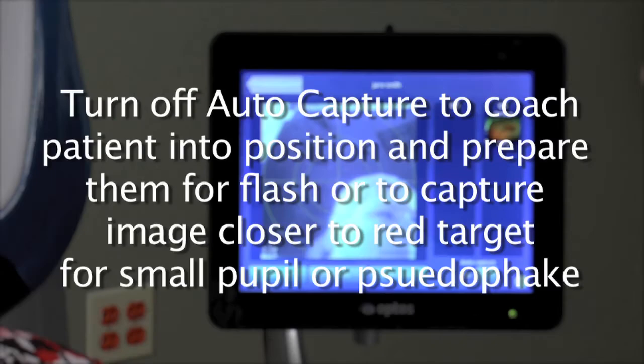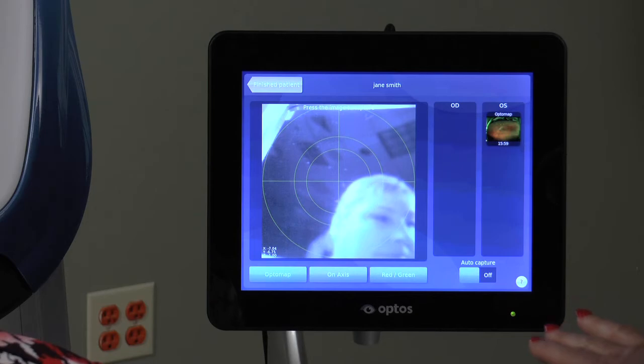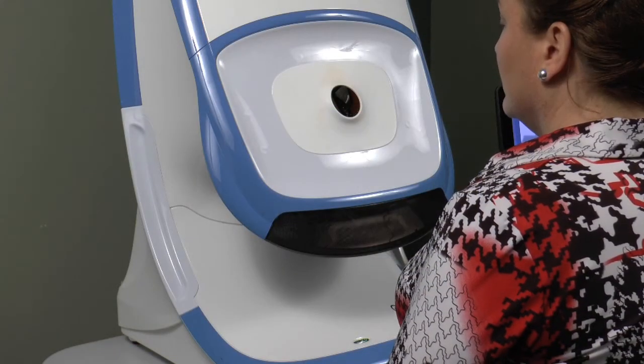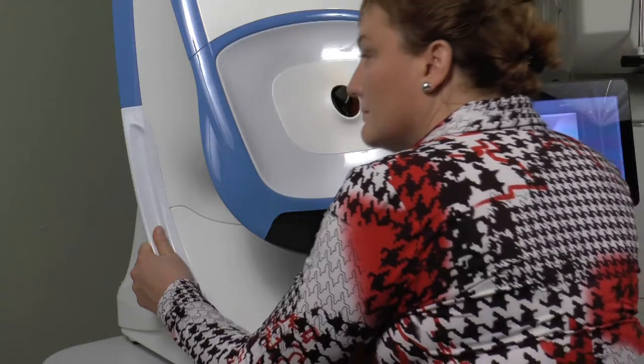Auto-capture is very quick and may occasionally produce an image that is not properly aligned or shows too much lid and lash. You can disable auto-capture by tapping the screen here as shown. To manually capture images, the operator will tap the touch screen when the patient is positioned correctly.